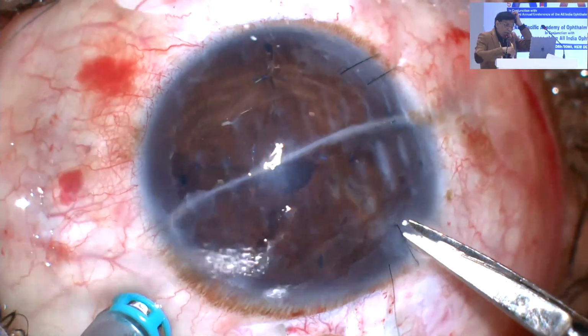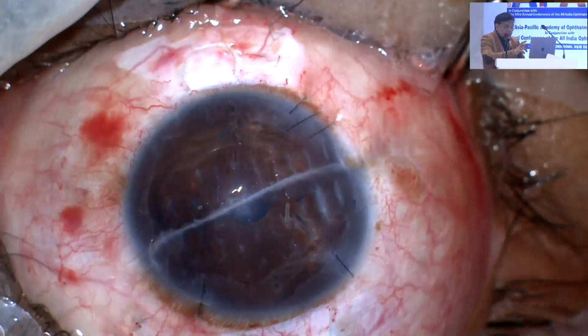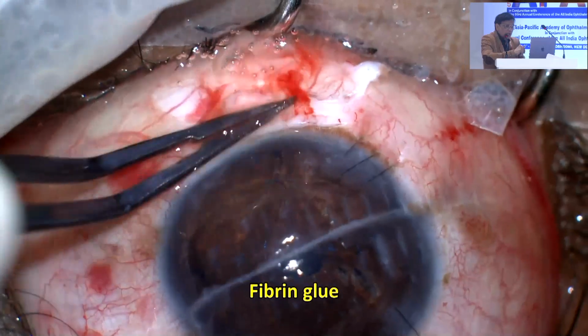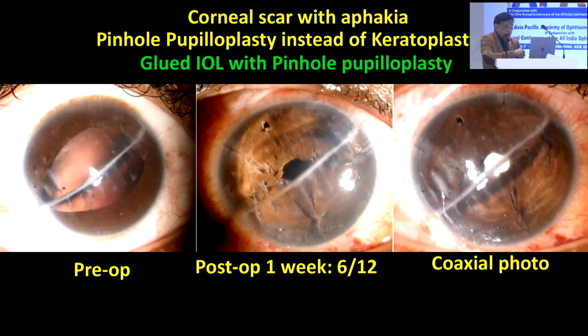Question comes, how did this patient behave? So the idea of this video was to show you, in cases like these bad cuts, which you will see there, injuries, etc., you can do the glued IOL, followed by the pinhole pupilloplasty, as I'm showing here. And look at this patient here. Pre-op, post-op 1 week, patient improved immediately to 6/12. That is just to show you a coaxial photo of the same case.